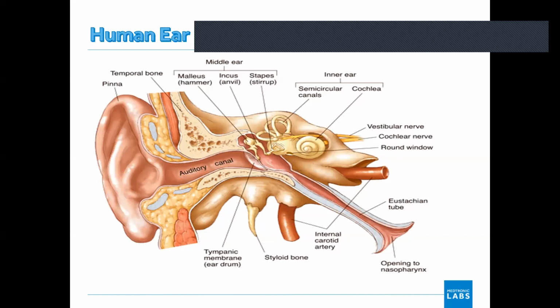So the tympanic membrane is one part we can consider to be in both the outer ear and the middle ear, because it divides the outer ear and the middle ear. It is like a wall. We can see the tympanic membrane's image with the help of the ENTraview or otoscope. So these three parts are in the outer ear.